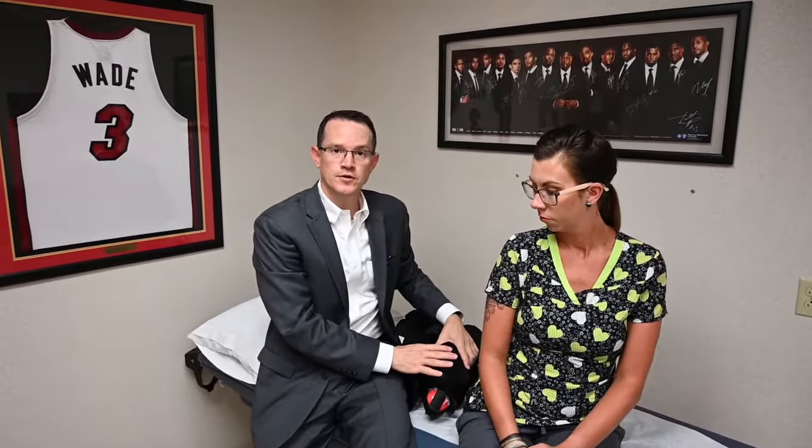After showering and before putting the sling back on, you can wear a shirt normally. The key is to start with the sleeve of your operative arm — in this case, the right sleeve. Simply take the sleeve and snake it up your right arm without lifting the arm up or away from your body. Then get the left arm in and wear the shirt normally. You can then put the sling on over your clothes, which is much more comfortable.